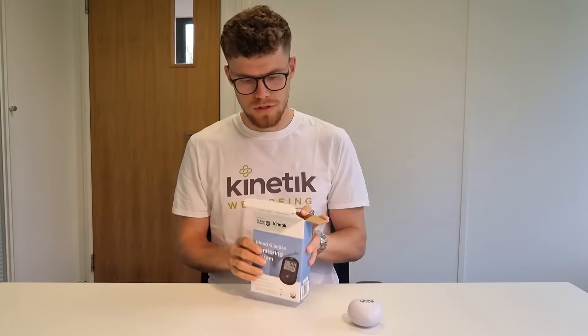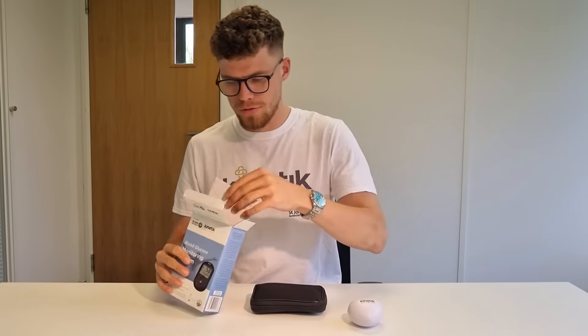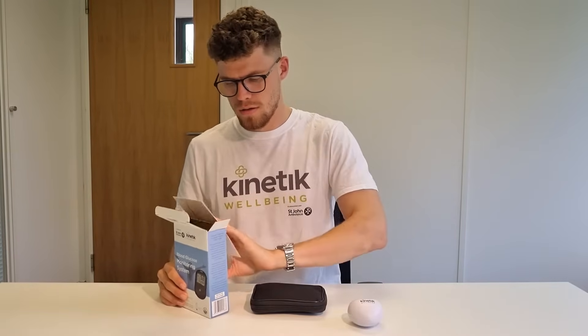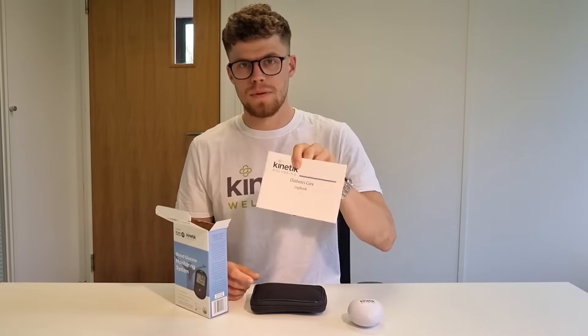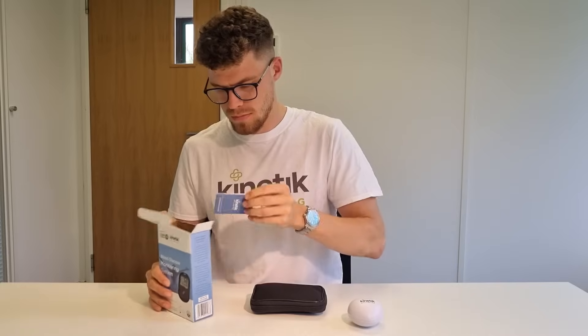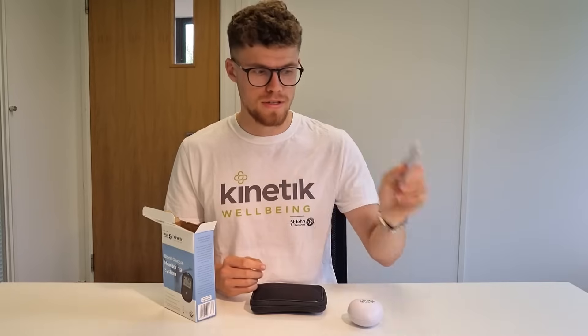This model is the non-Bluetooth version. Inside the box you're going to find a user manual, a diabetes care logbook, and a quick start guide. If you're not using this video, a quick start guide is a great place to start.